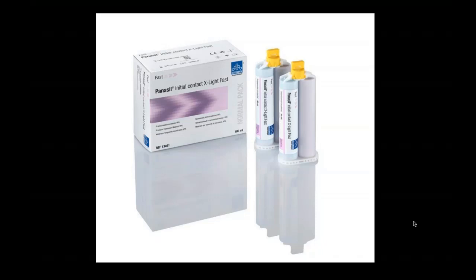Any issues with Panasil not adhering well to the putty? No, I have never had that. I mean, you can actually peel it out if you need to. I've actually done that, but I've never had a problem with that for a diagnostic model. Remember, this is a diagnostic model, and you're good. Yes, you're going to use it for 6 months smile. You're going to use it for Invisalign, but I've never had a problem, and I've used it many times with that. So let's go on here.